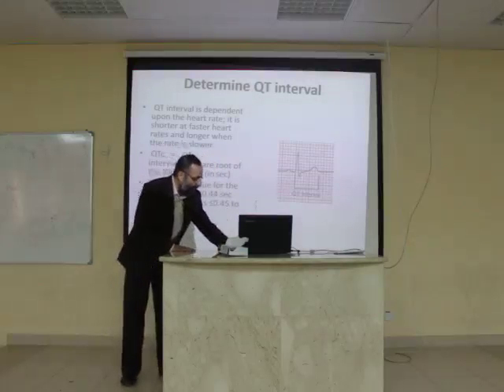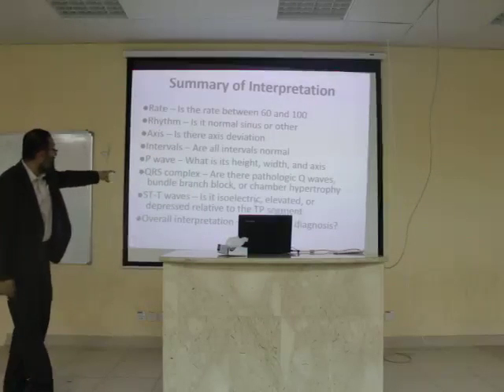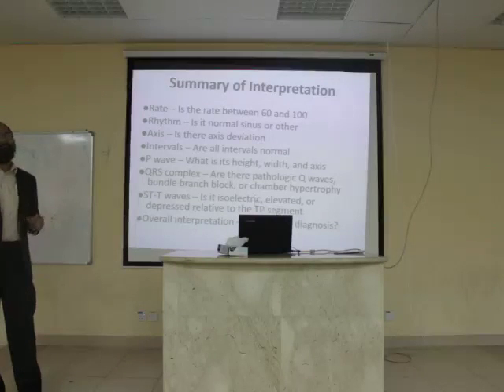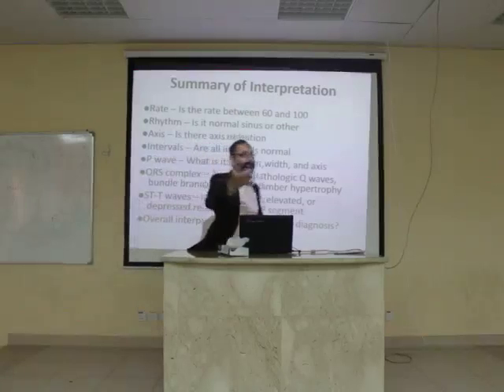This is the summary which is coming now. Rate, rhythm, axis, interval, P wave, QRS complex, other waves and overall interpretation. Finally, you make the diagnosis of the ECG. This will come in steps really. It is only a beginning.